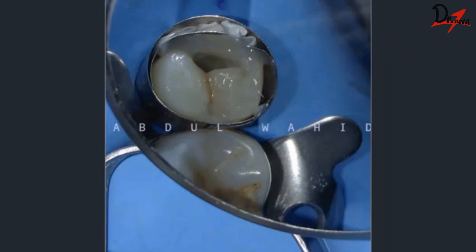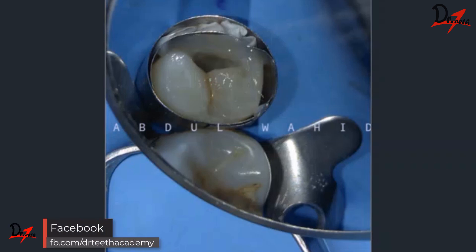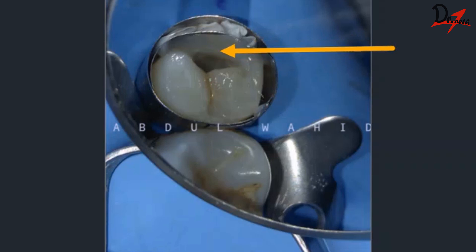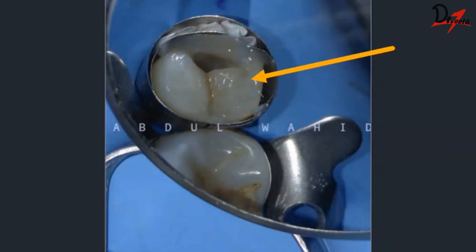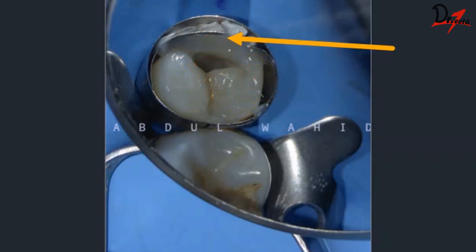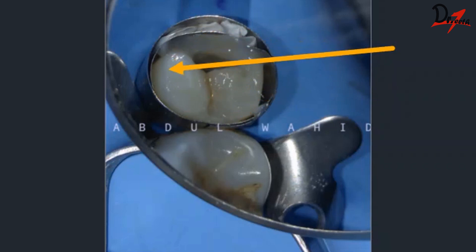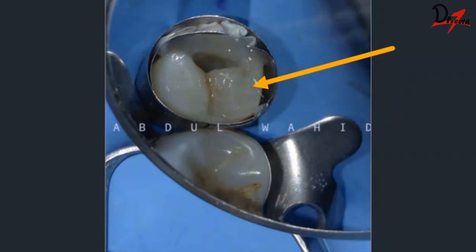After proper acid etching and caries excavation, we went ahead with the pre-endodontic buildup. Pre-endodontic buildup is essential for two reasons: first, it serves as a reservoir for sodium hypochlorite during endodontic treatment; second, if you cannot finish in a single appointment, retention of the temporary filling is much better when all four walls are present. Pre-endodontic buildup means building up the missing or decayed wall with composite or restorative material — I always prefer composite.